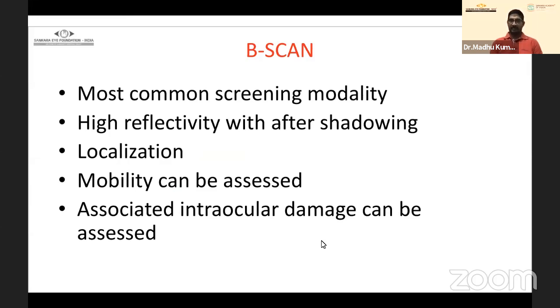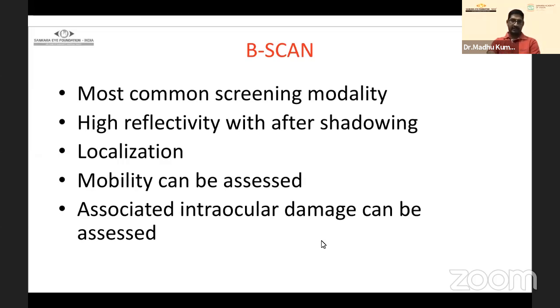B-scan is the most common screening modality, as it is a tool all ophthalmologists have access to. High reflectivity and acoustic shadowing is a typical picture of a metallic foreign body. Localization is better with B-scan, and it scores over CT and MRI in delineating associated intraocular damage — vitreous hemorrhage, retinal detachment, subretinal hemorrhage, or choroidal detachment.